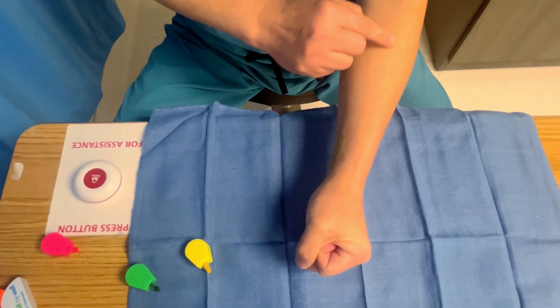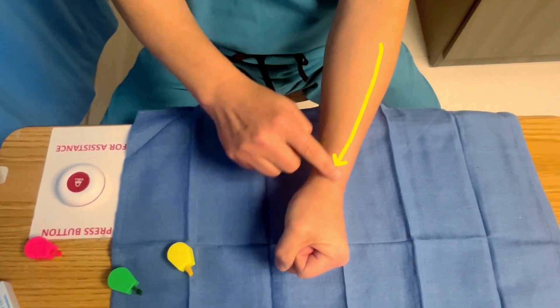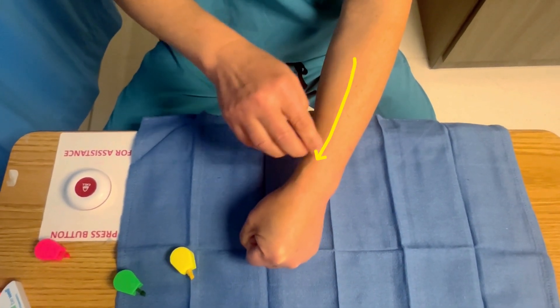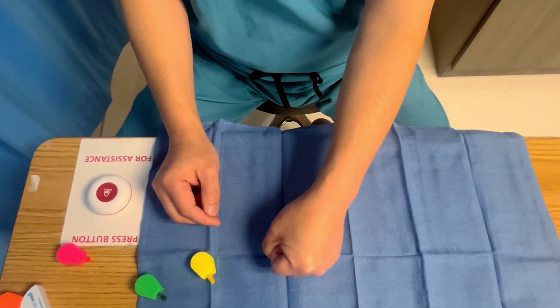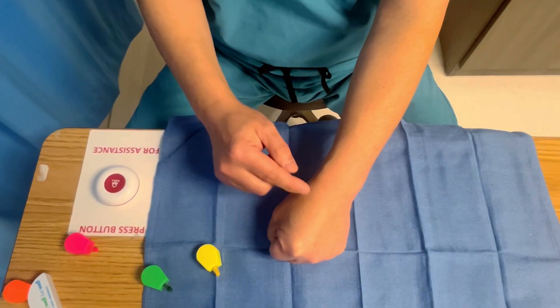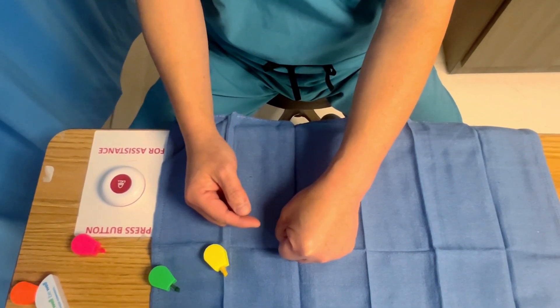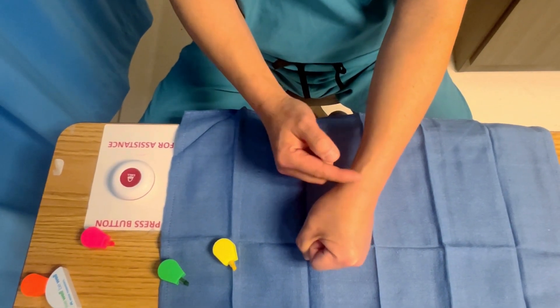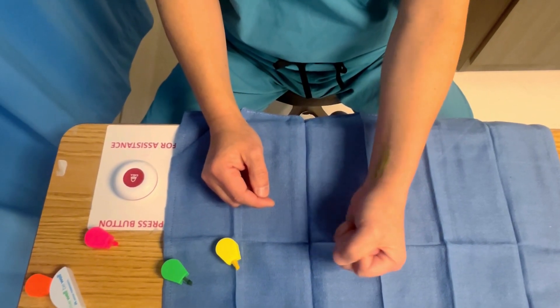The radial nerve travels along the lateral side of the forearm, and at the wrist level it divides into numerous terminal branches to innervate the dorsal of the hand. You can inject local anesthetic subcutaneously to block the radial nerve.